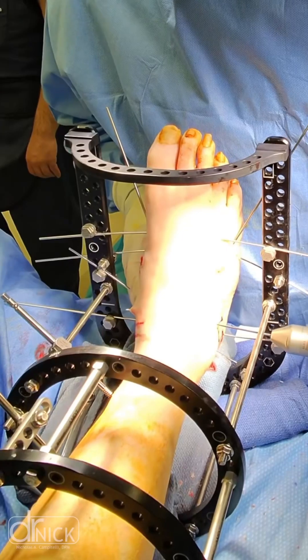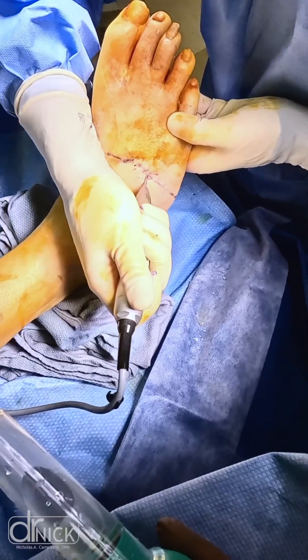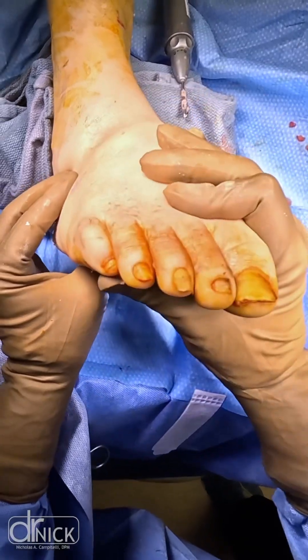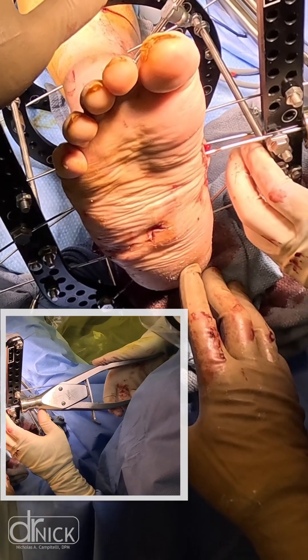We used a two-ring construct with a foot plate, and utilizing the Arthrex minimally invasive burr, we were able to perform a midfoot osteotomy and reconstruct this arch — moving from a rocker bottom foot to a plantar grade foot — that took away the pressure that was causing this ulceration.